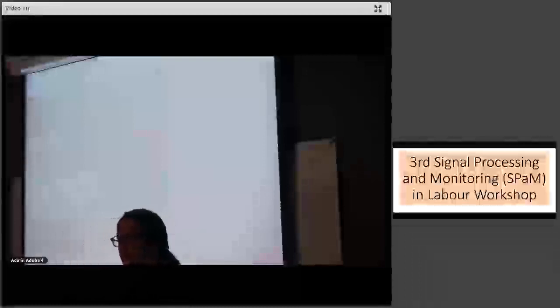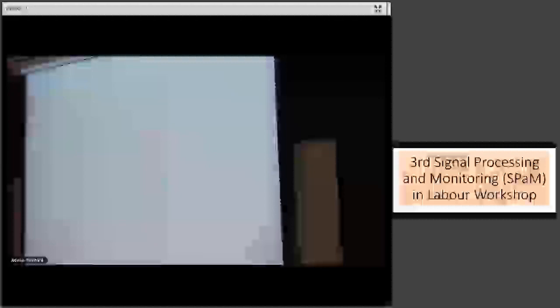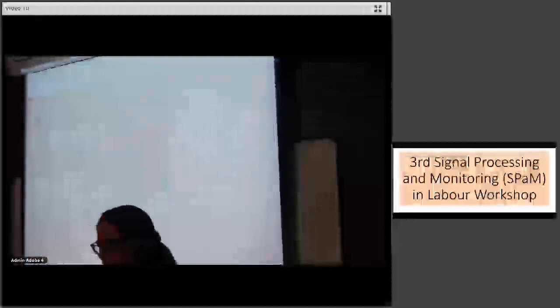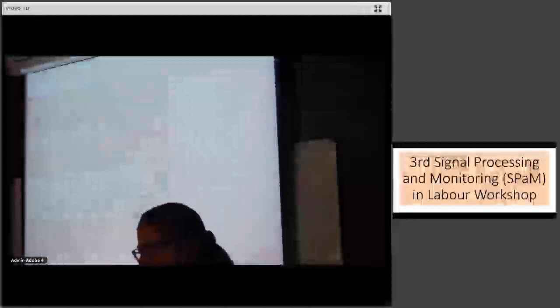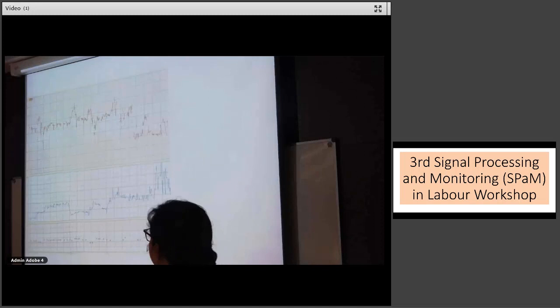I will add on just to pick up on the question he asked. I think if the fetal heart rate variability is normal, the chances that you're going to get an acidotic result is exceedingly small. So for that reason, I won't do one. Secondly, if, as we think here, there may be infection playing a role, you could easily be positively misled by a near normal result and think all is well. And that encourages you to press on with it.